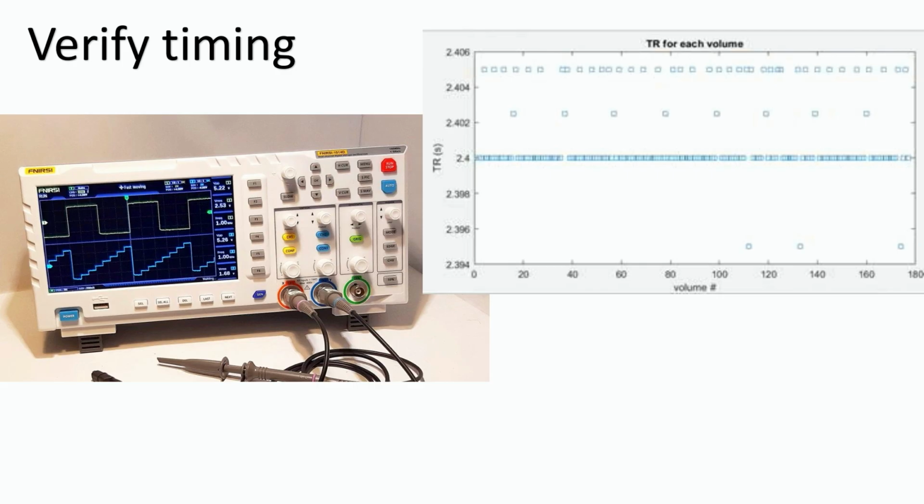There's this little pin that you stick into the TMS box with that little orange circle on it that verifies the heating of the TMS coil and also which TMS coil you have plugged in. And if you bend those pins a little bit, you can sometimes get the information and sometimes not. That recently happened to us.